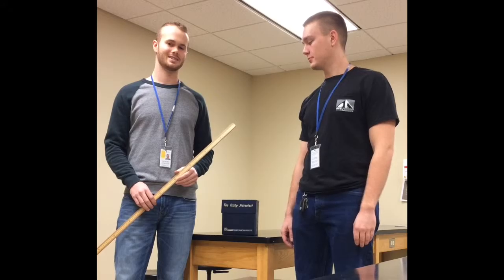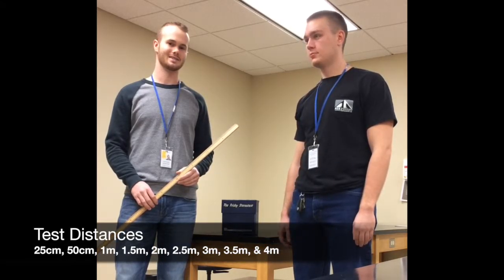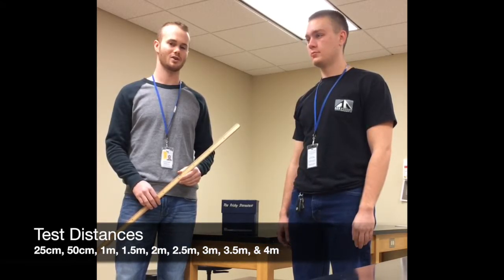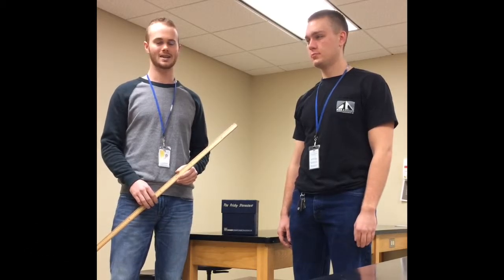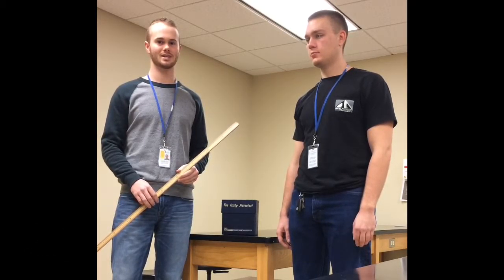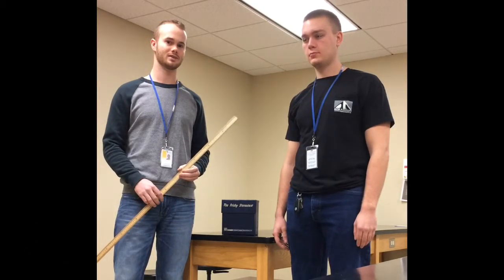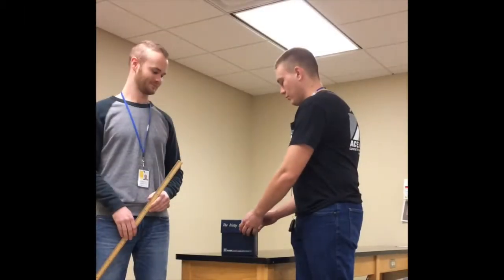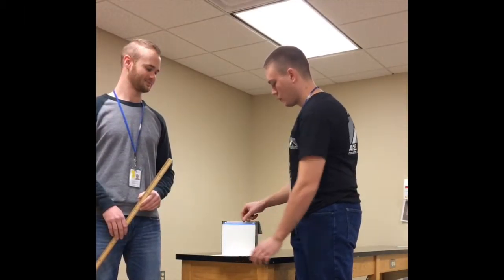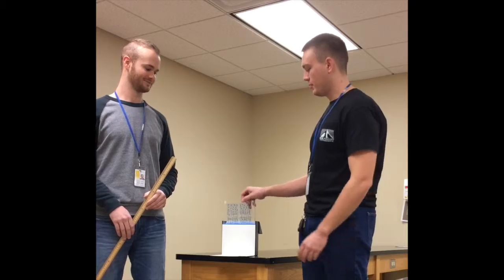This Stereo Acuity Test is performed at nine different test distances, ranging from 25 centimeters all the way to 4 meters. At each test distance, the patient is forced to do 10 trials apiece for accuracy. At each test distance, we have a choice between three different plates.